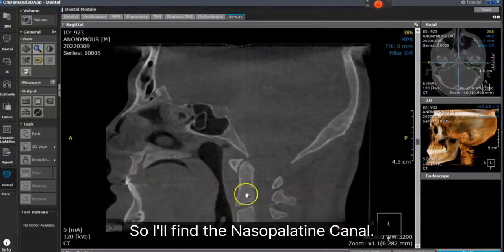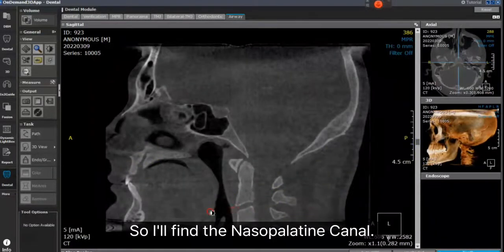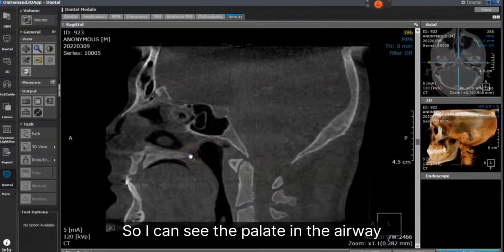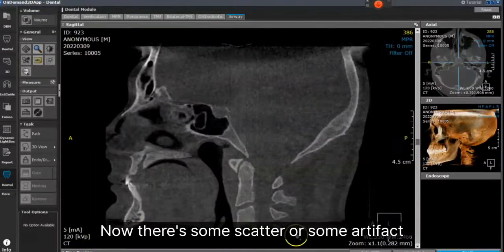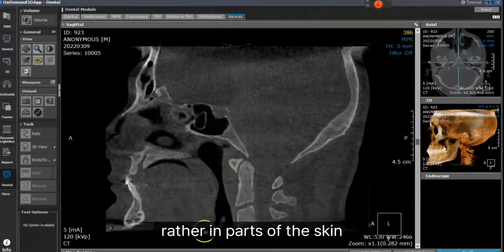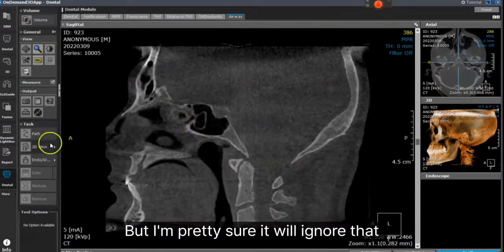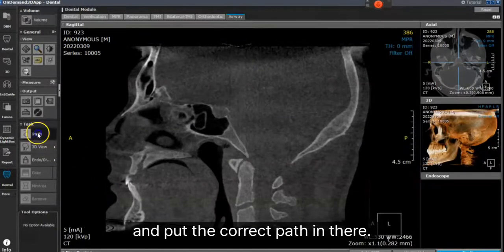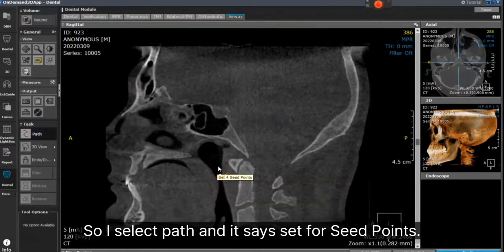I'll find the nasopalatine canal. I'll right-click and do a little contrast enhancement so I can see the palate and the airway. Now, there's some artifact in parts of the scan, but I'm pretty sure it will ignore that and put the correct path in. I select Path, and it says Set 4 Seed Points.